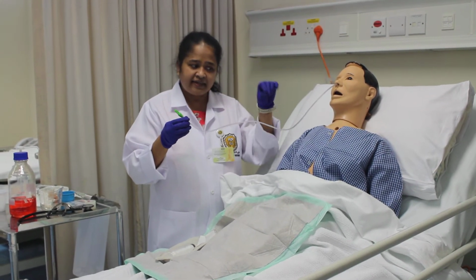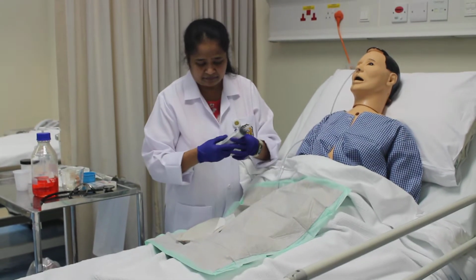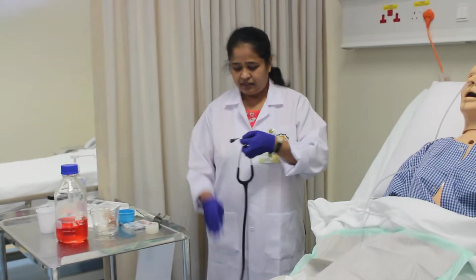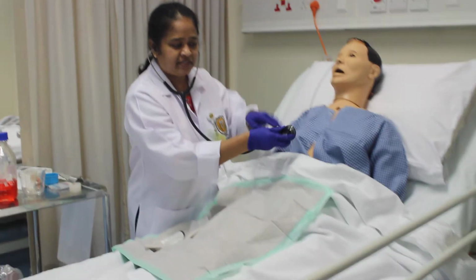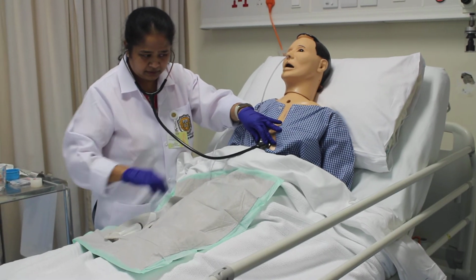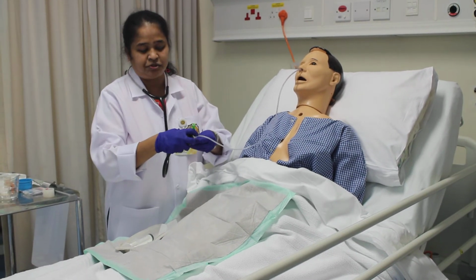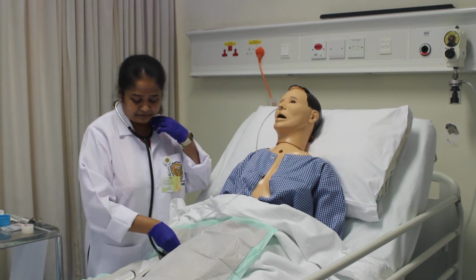Now we want to know exactly whether it is in the stomach or not. The first test is, I want to take 10 to 30 ml of air. I have cleaned my stethoscope already, and I will be keeping my stethoscope in the epigastric region. When I push air, I should be able to hear a whooshing sound. The whooshing sound is nothing but air passing inside the stomach.